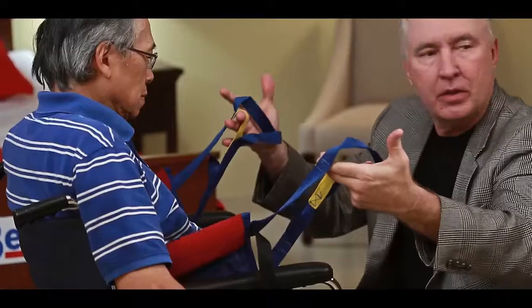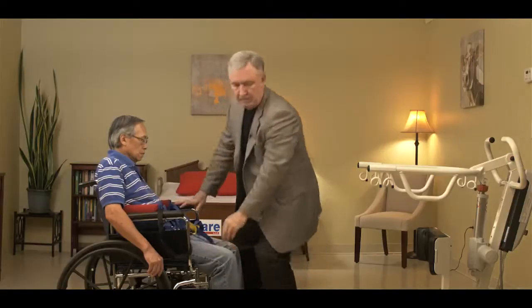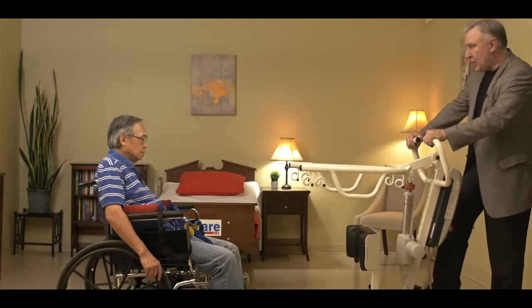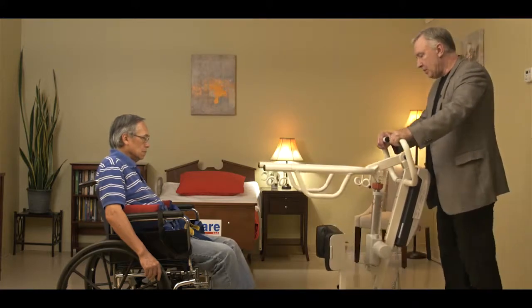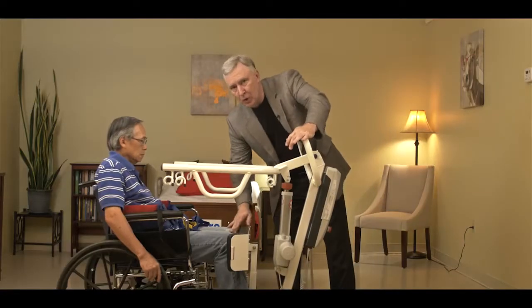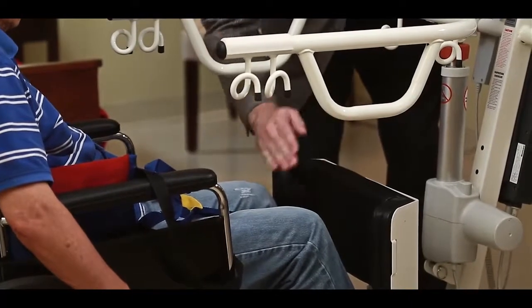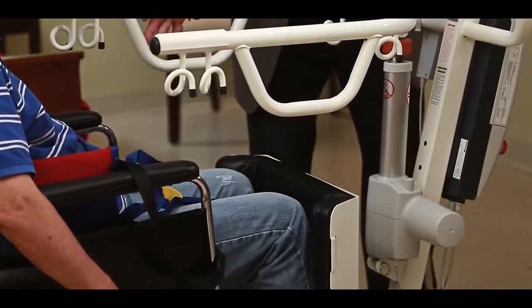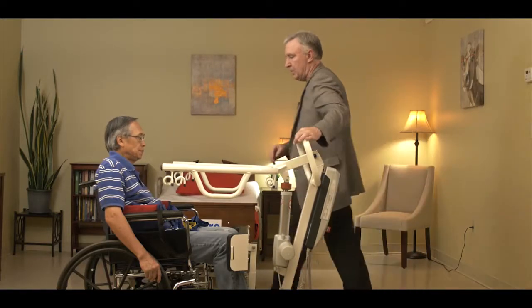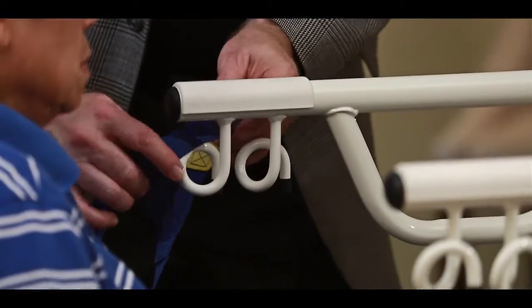Tighten it so it's nice and secure around the patient's waist. Now make sure you have access to the sets of loops on the support vest. The next step: bring our sit-to-stand SA product up to the patient, open up the base, put the feet on the platform, and bring the knee brace as close as you can to the patient's knees. If needed, adjust the knee brace in and out, up and down so it's in the right spot. Then lock the wheels and connect the loops on the vest to the hooks on the SA.